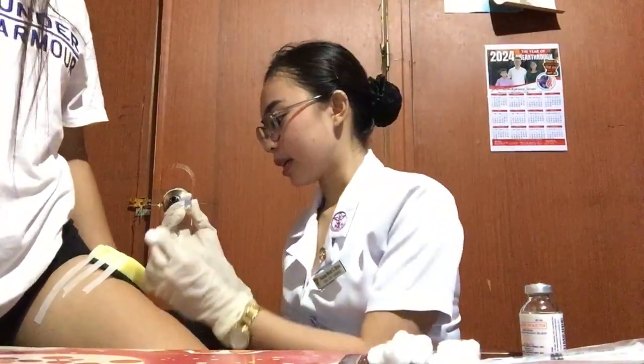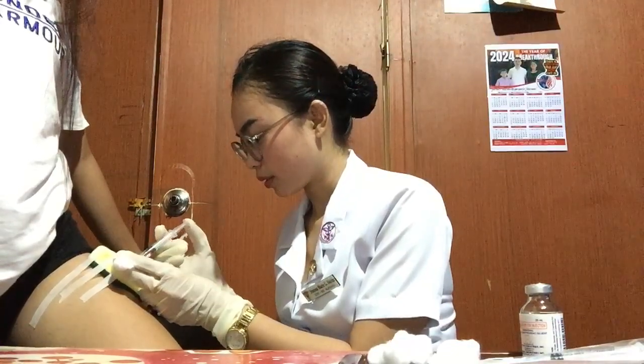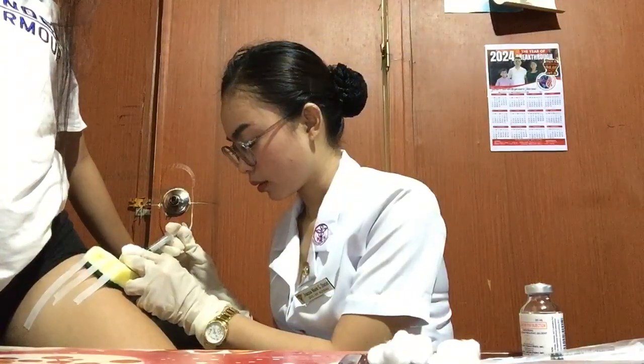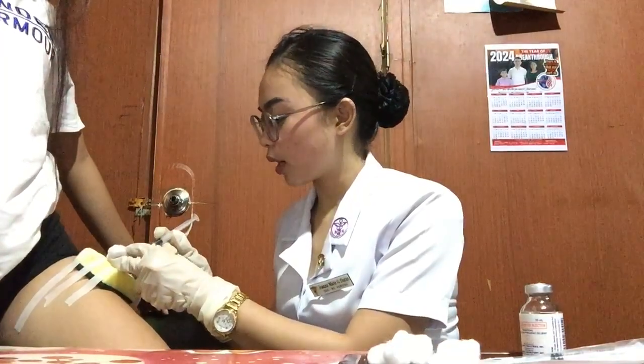And then remove the needle. If blood appears in the syringe, withdraw the needle, discard the syringe, and prepare a new injection.